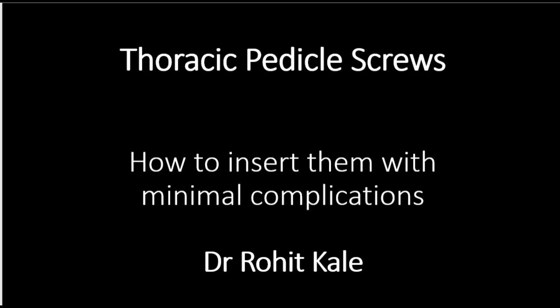This video is meant for doctors, spine surgeons who want to improve their ability to pass thoracic pedicle screws. This video is not meant for patients. If you are a patient, we'll probably make another video for you. This is a longer and more technical video. So without further ado, let's start.